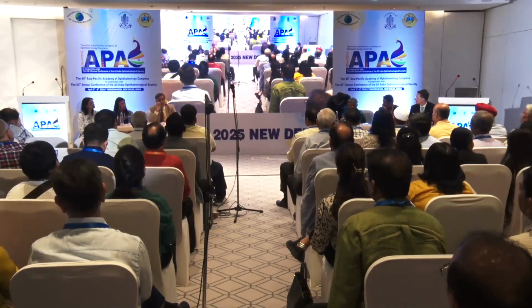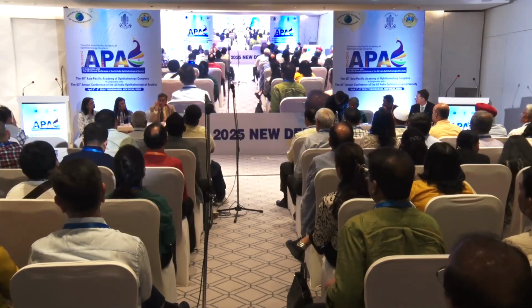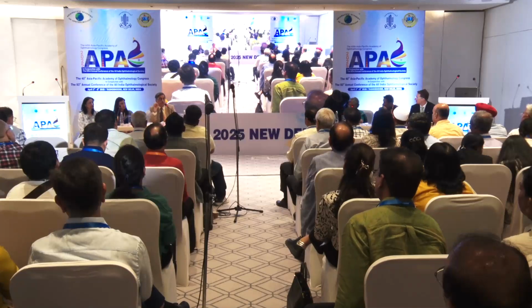Thank you, Dr. Yadav, for a very well-defined lecture, which has made it very clear as to what are the new things which we can see. You know, till 2 decades back, हम आँख को सिर्फ देखते थे, ऑप्थेल्मोस्कोपी करते थे, ठीक है कुछ swelling है, कुछ white है, कुछ point है, कुछ dot है. Today, we are not replacing your clinical acumen with a machine. We are increasing the ability of your eye to see the ultrastructure of the eye.